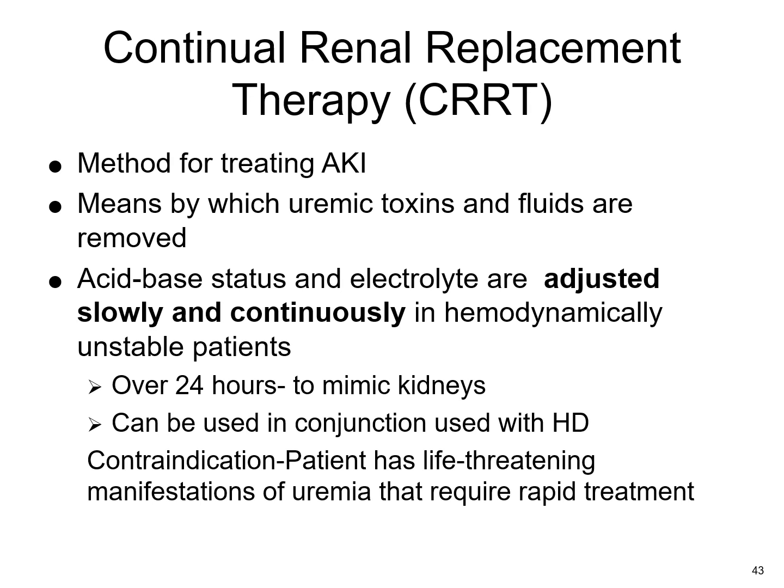So continuous renal replacement therapy. These are primarily used for treating AKI. Here you're basically trying to get rid of uremic toxins and fluids, similar to hemodialysis, but the main thing, which is in bold for a reason, is that you're doing this slowly and continuously, right? So it's in patients who are hemodynamically unstable, but we have the time to be doing this treatment slowly. So it's not like an emergency situation, because hemodialysis is very quick.